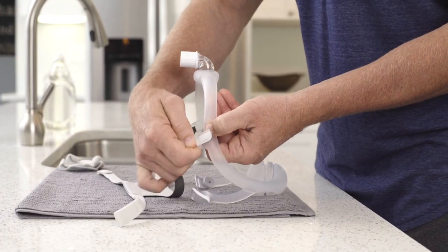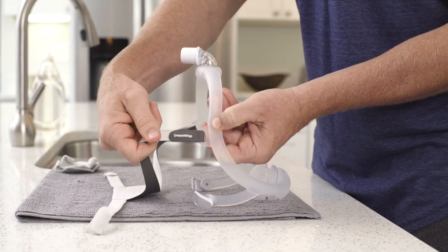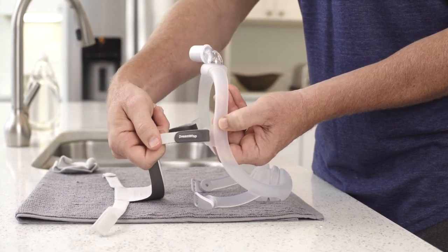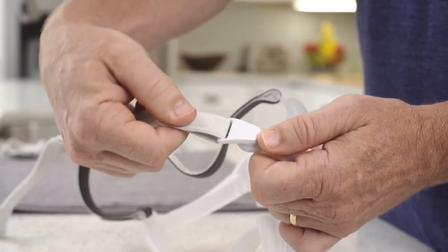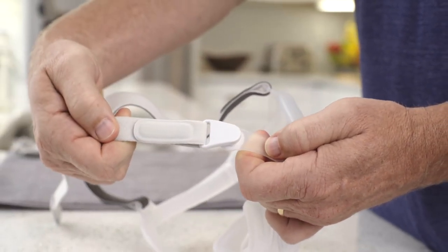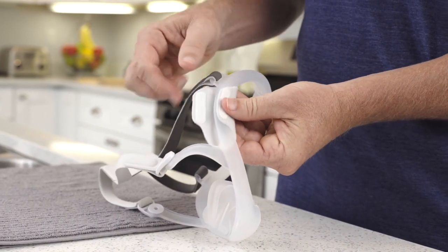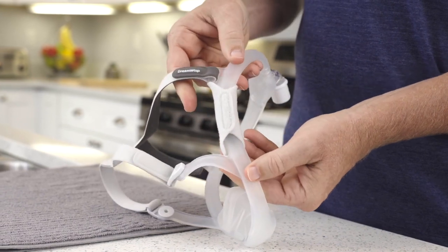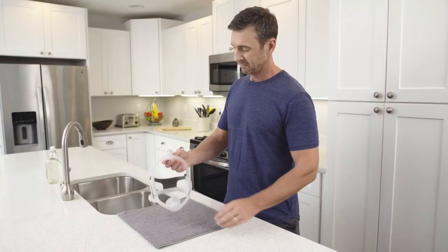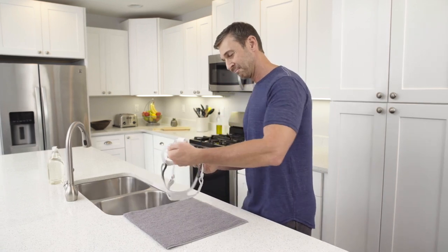Now slide the tabs of the top strap into the slots at the top of the mask frame. Fold the tabs to secure them to the strap. Insert the tabs of the bottom strap into the slots on the magnetic clips. Once again, fold to attach. Wrap the optional fabric sleeves around the mask frame so that the seams are on the outside, away from your face. Your DreamWisp mask is now correctly assembled and ready for use.